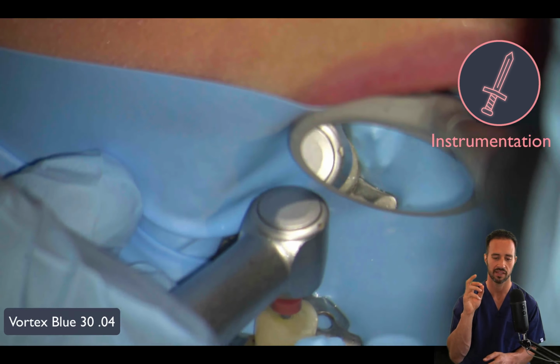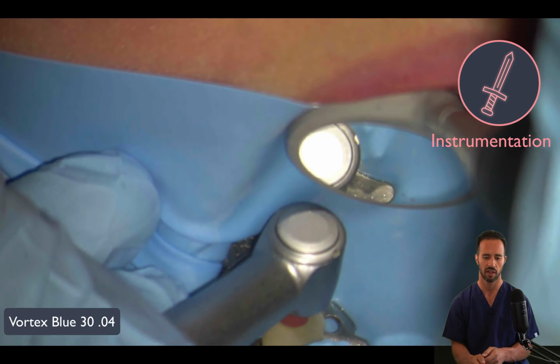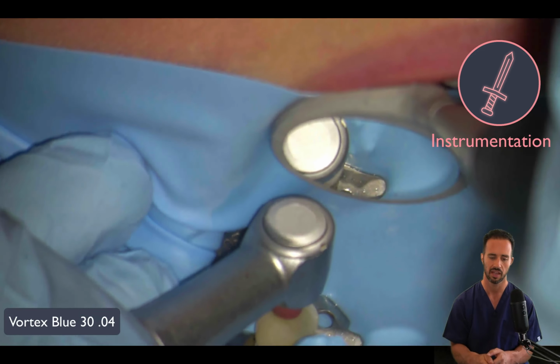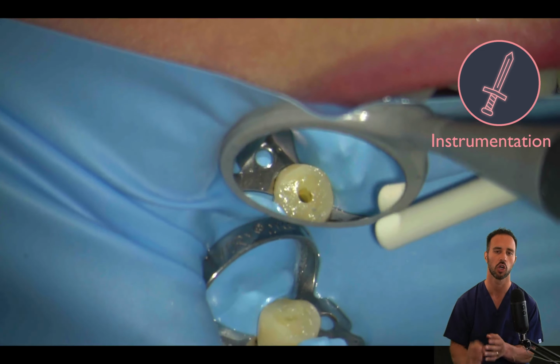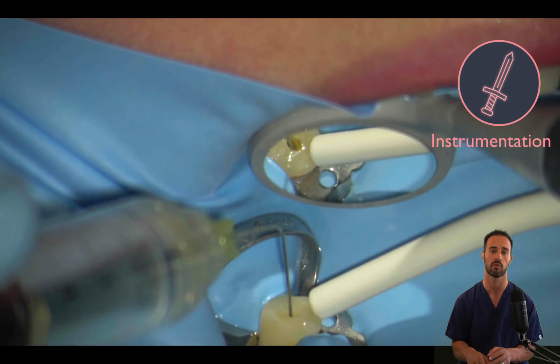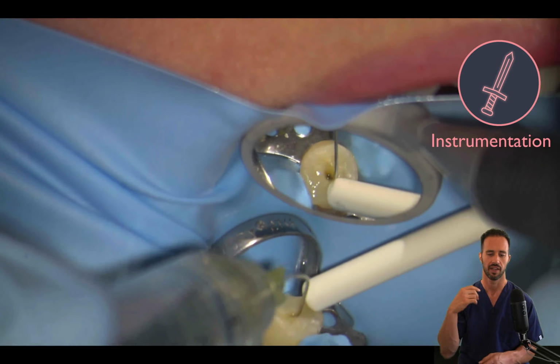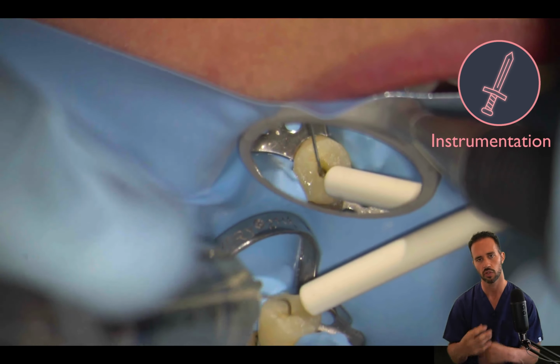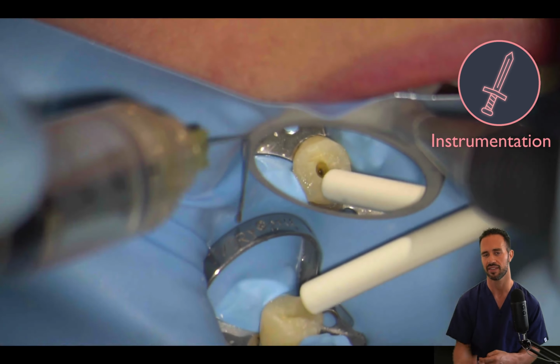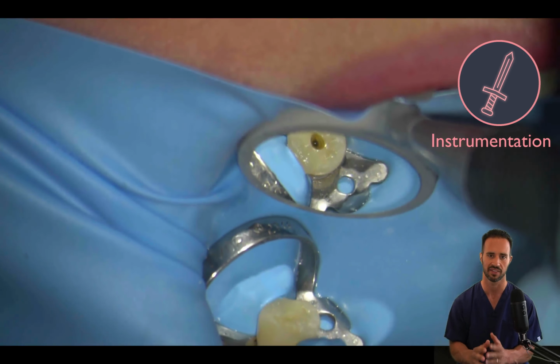So we have our size 30 04 Vortex Blue rotary file, again to 23 millimeters. Every rotary file, other than our orifice opener, goes to length. That would be what I would recommend, and I'll discuss that in world number 3. But again, more sodium hypochlorite. The cumulative effect of all this sodium hypochlorite is really what's going to make the difference in terms of making sure that your case is fully disinfected.